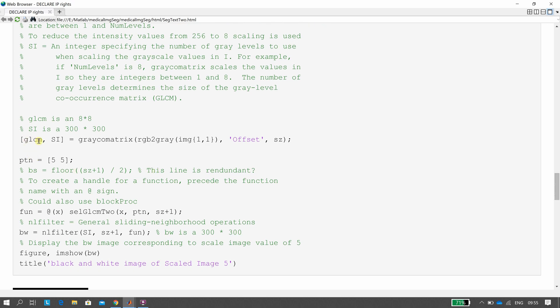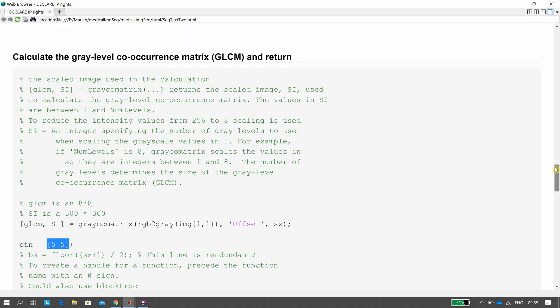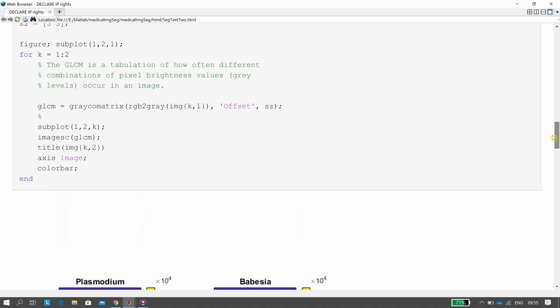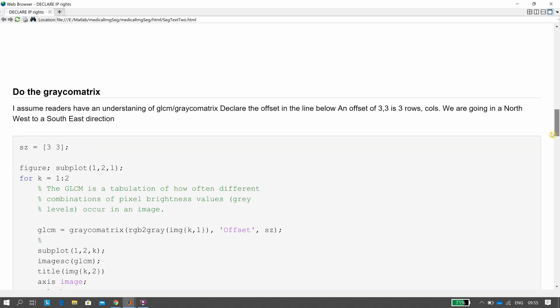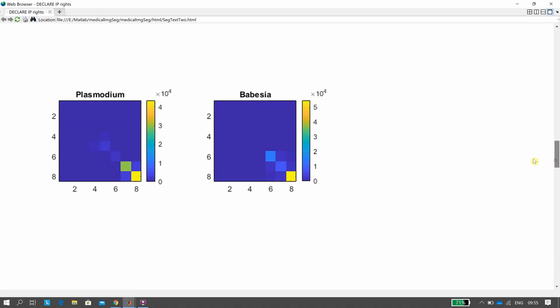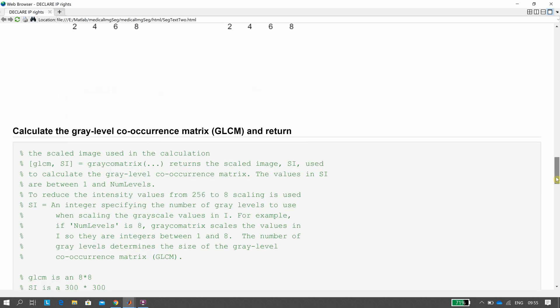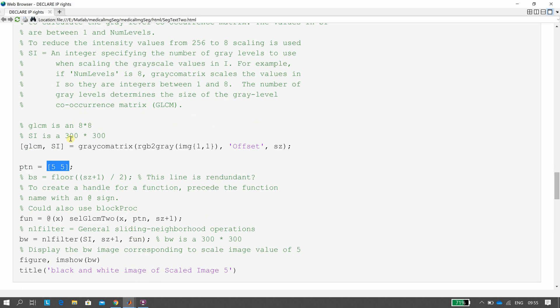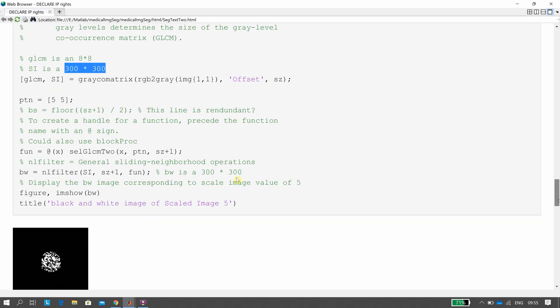So we've got the GLCM and the scaled image, and 5,5 are the values we're looking at. We want to find the co-occurrence value 5,5 in the GLCM. We want to find 5,5 in the 300-by-300 image that we read in. So we want to go through that and find where 5,5 occurs, and we do that here.